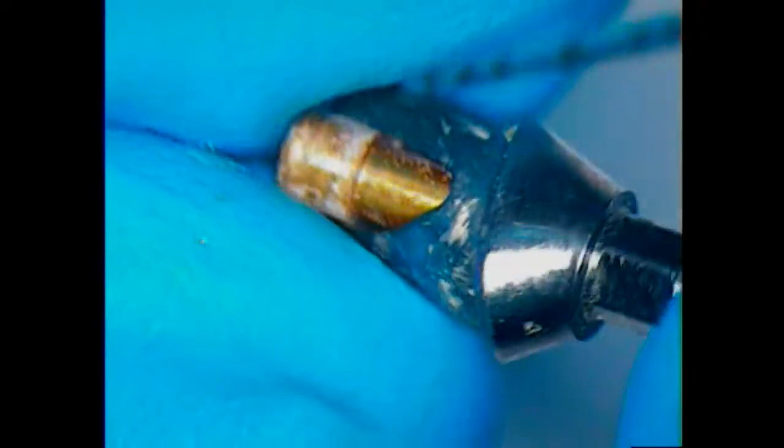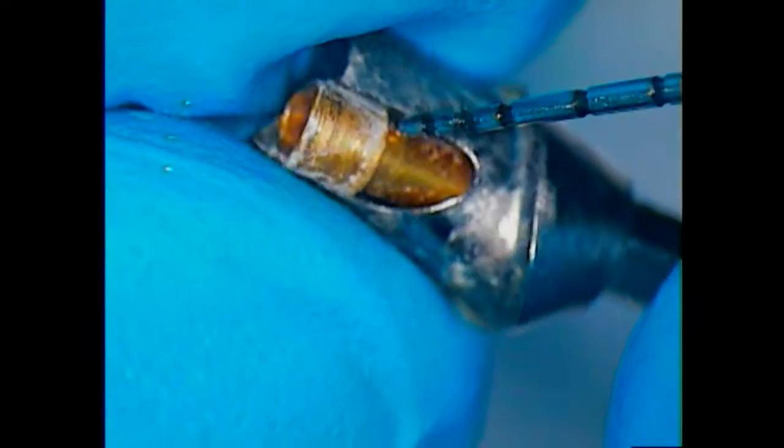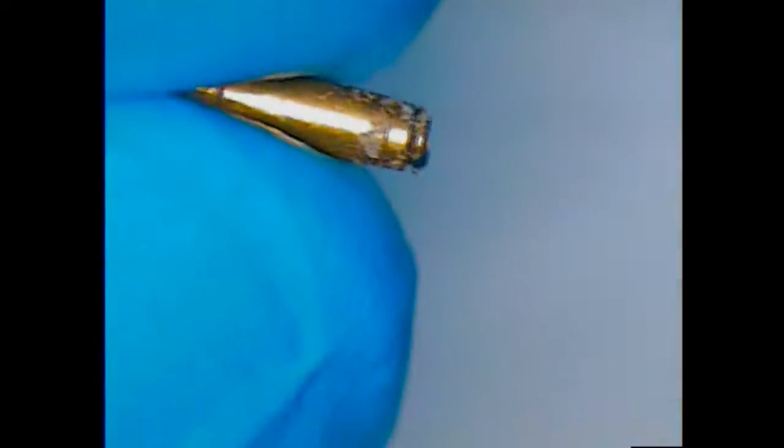I'm going to push it through with the periodontal probe and there's our gold screw — it's gold covered. The reason why they gold cover them is to increase the amount of strength in the threads so that when it tightens down it develops a certain amount of resistance to dislodging.